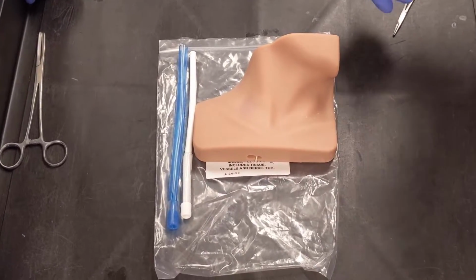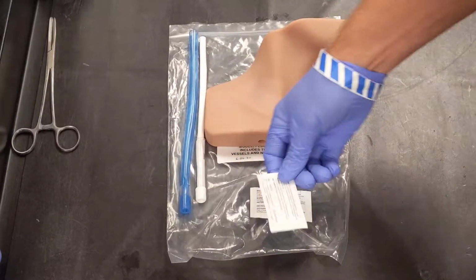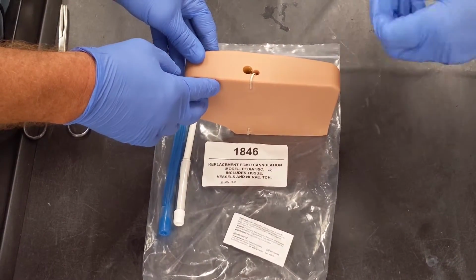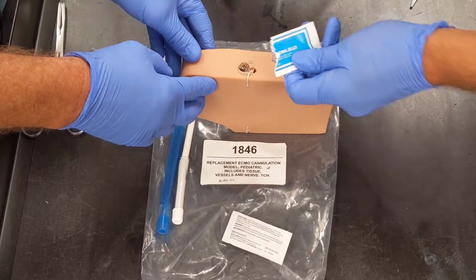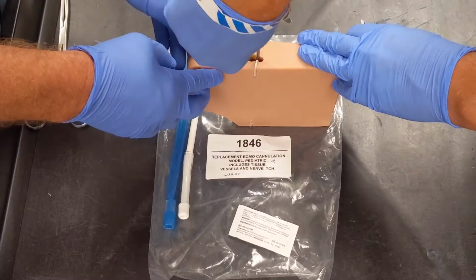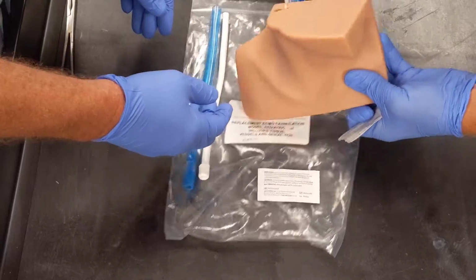We're going to go over how to load the vessels into the ECMO neck. It comes with 2 vessels, an IJ and a carotid, 2 packs of lubricating jelly, and the neck. So there's 2 open channels. You want to just squeeze, use any kind of a long clamp to gently just kind of work it in. And this will help the vessels adjust. We'll show later.